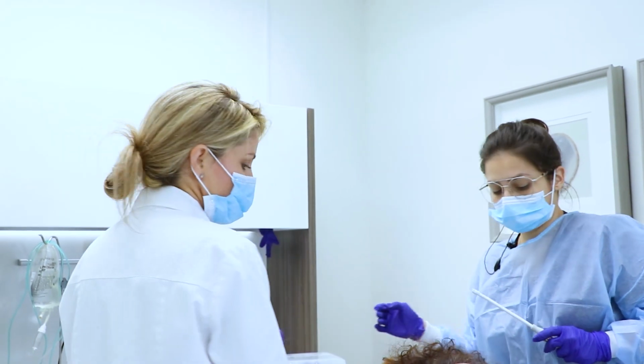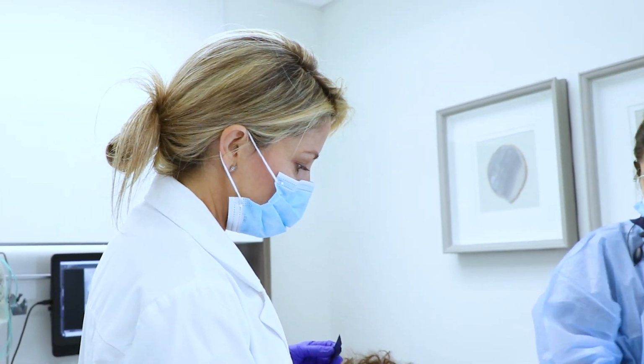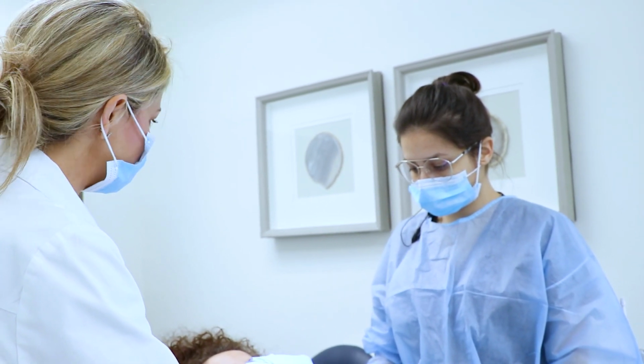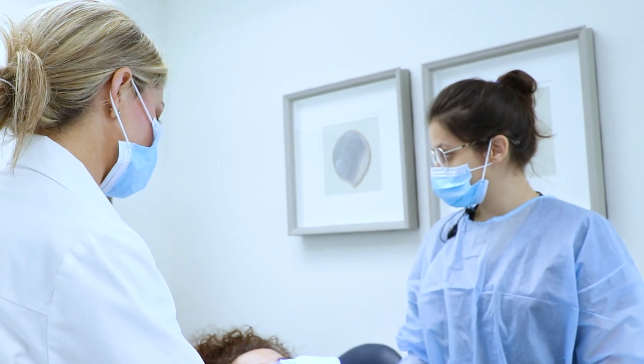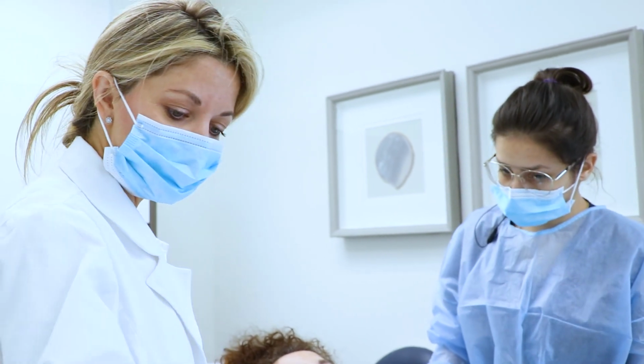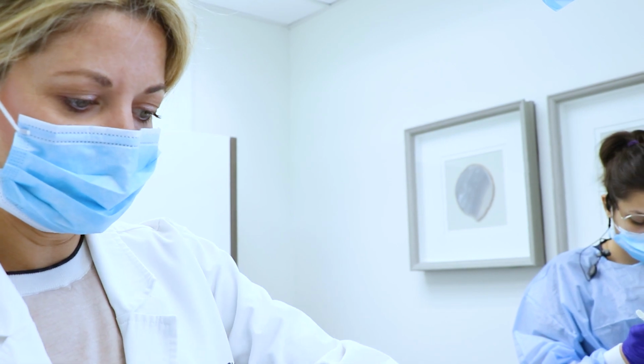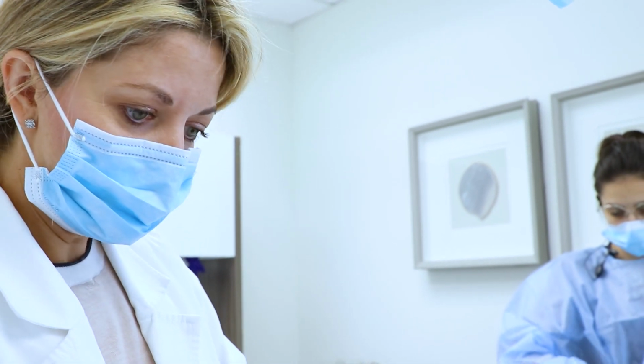And now we'll check the bite. Side to side and open. Thank you. And you can see there's a spot there that's pretty high. And so we'll just adjust that down. A little bit of water.